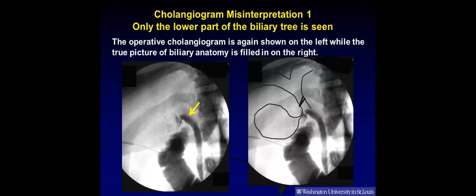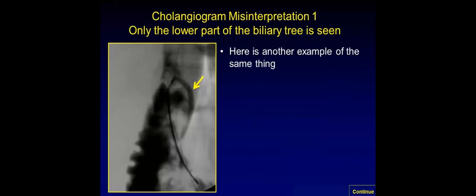The operative cholangiogram is shown on the left while the true picture of biliary anatomy is filled in on the right. Here is another example of the same thing. Only the lower part of the biliary tree is seen. Remember, this almost always means that the common bile duct has been cannulated rather than the cystic duct.